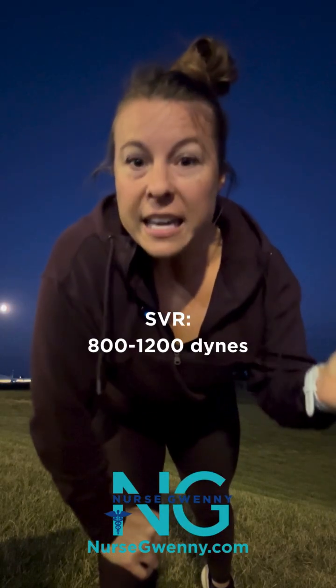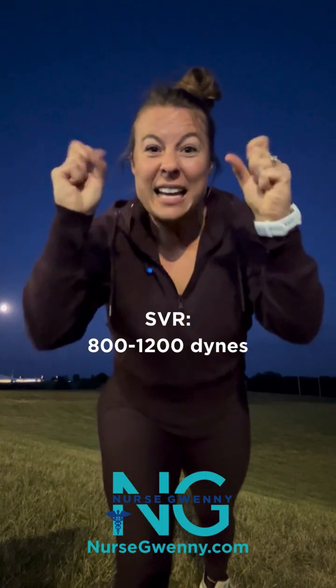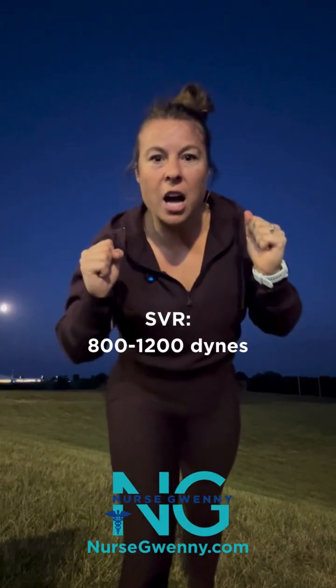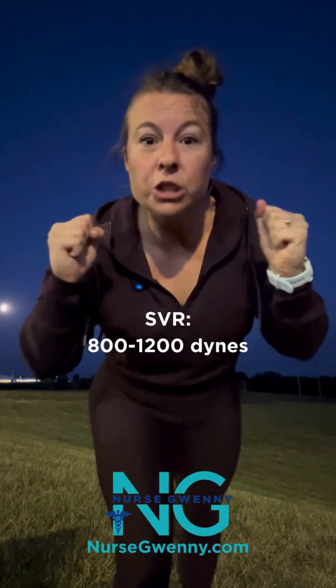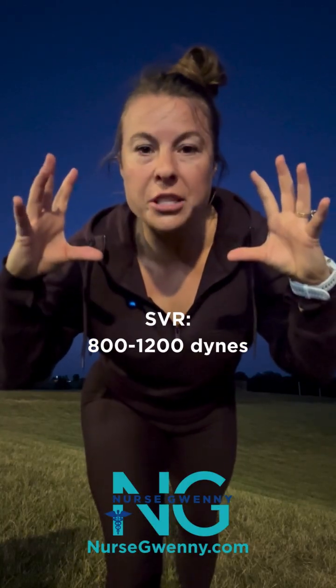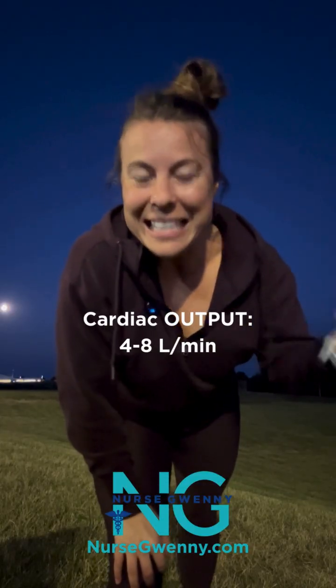Now, this Swan-Ganz also has a lot of calculated pressures that it will give us. It will tell us the SVR. That's our systemic vascular resistance, right? And that's measuring how tight the vasculature is, right? Think about if you're in anaphylactic shock or septic shock or neurogenic shock, that SVR is going to be super low. You've lost your vascular tone. It's gone bleh. And also cardiac output and index.